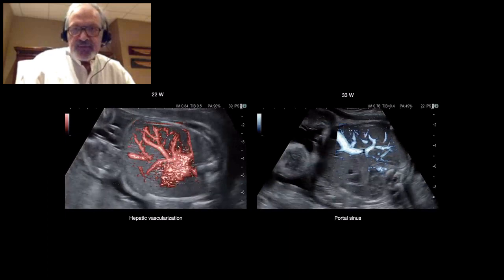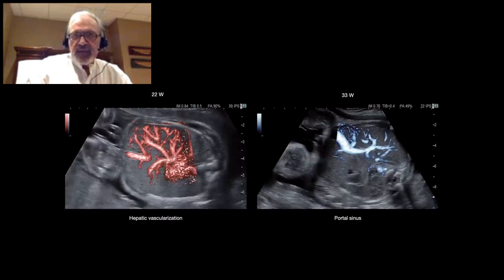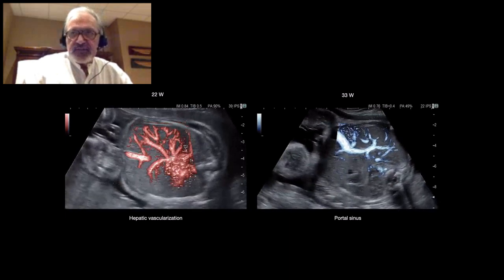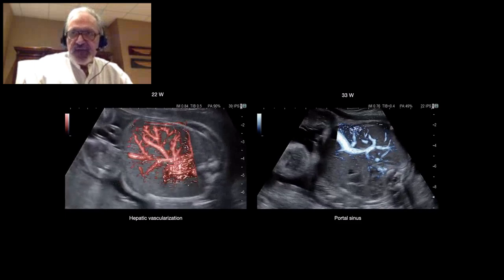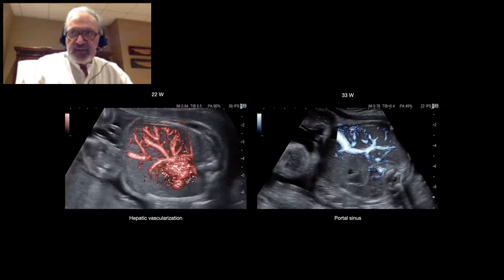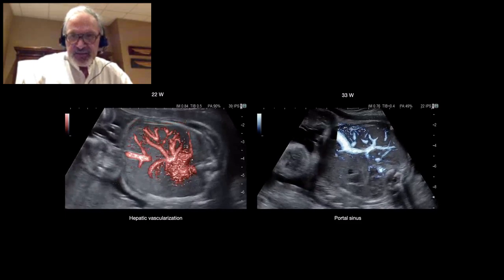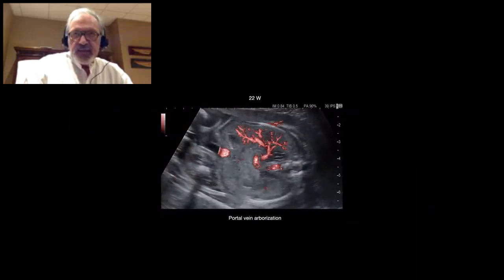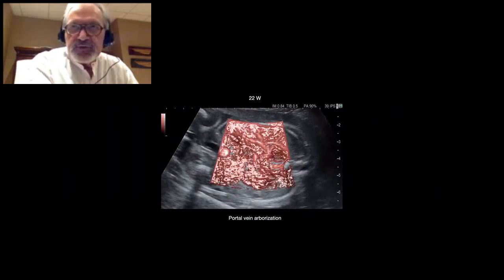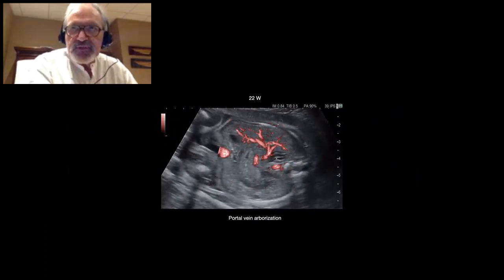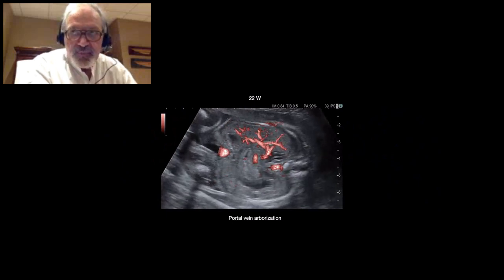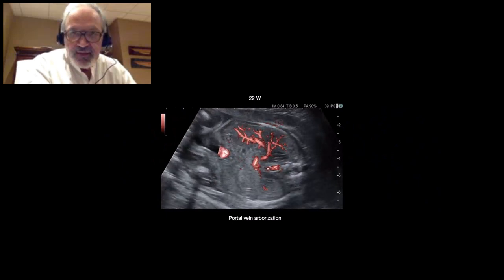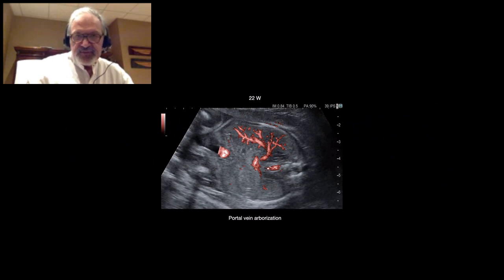Later in pregnancy, as you can see here, the umbilical vein and its collaterals, as well as the portal sinus, are well defined. Here, we have the portal network at the lower part of the liver. And you can see we have good definition of the flow.